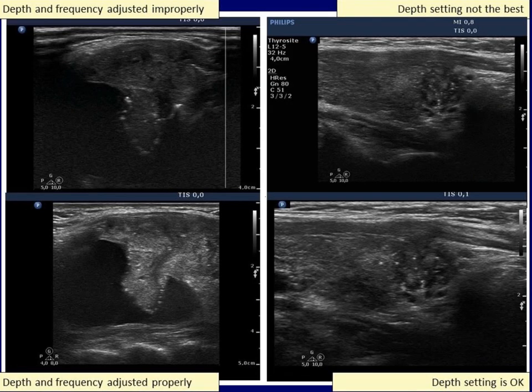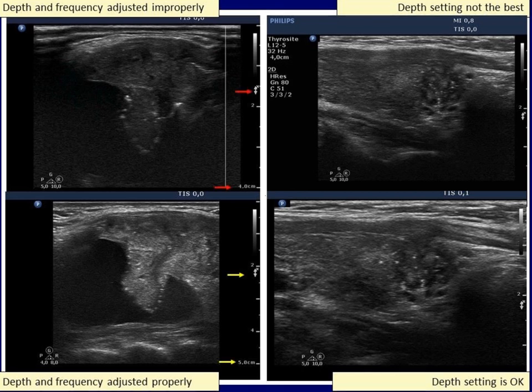Let's analyze the left nodule. In the upper image, neither the depth nor the frequency was appropriate. Therefore, the dorsal parts of the nodule were impossible to judge. After correcting the settings, the situation became much better.